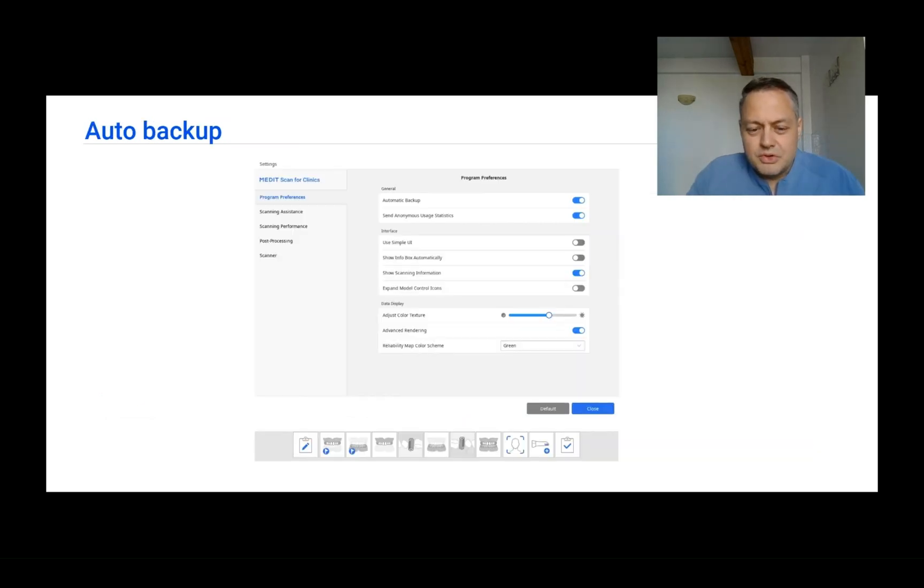Every scan is composed of multiple stages visible at the bottom of the screen: pre-op maxilla, pre-op mandible, maxilla and mandible operation stage, scan body stages for face scan, and the face scan stage — which also covers CT DICOM file loading converted to STL. In that stage you can also import any STL, OBJ, or other compatible file. Additionally, there is an additional scan stage that lets you scan anything and correlate it to the case.